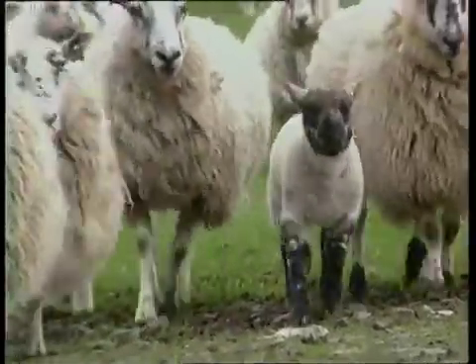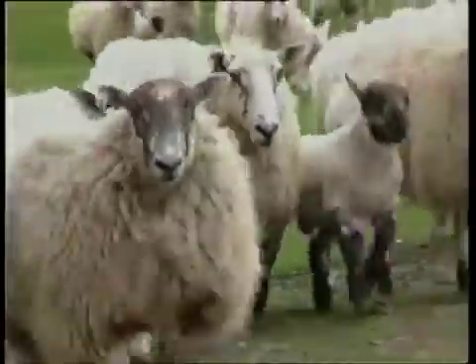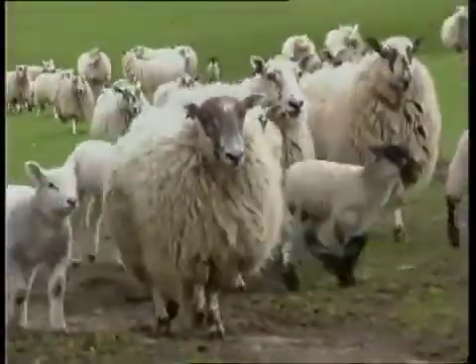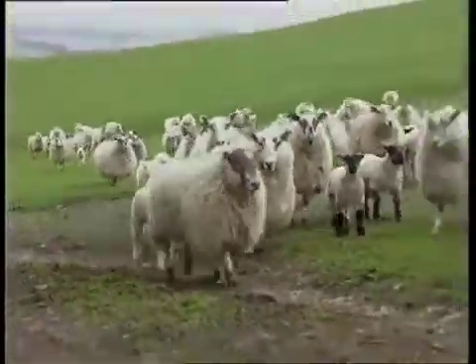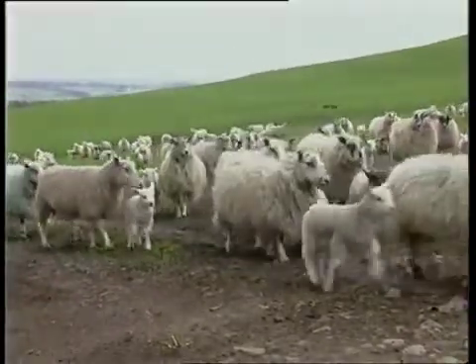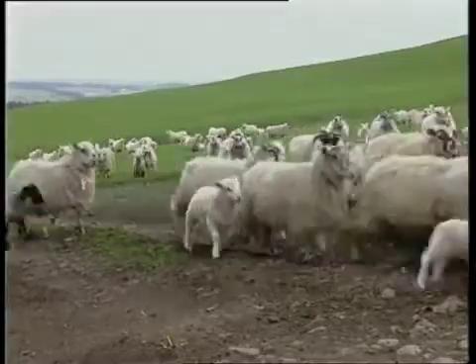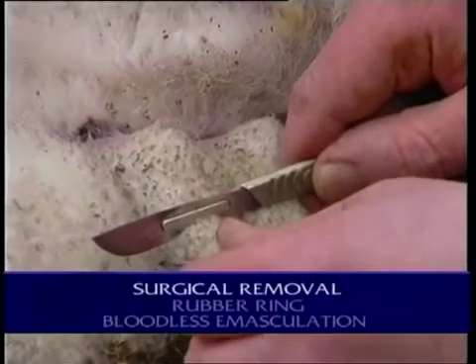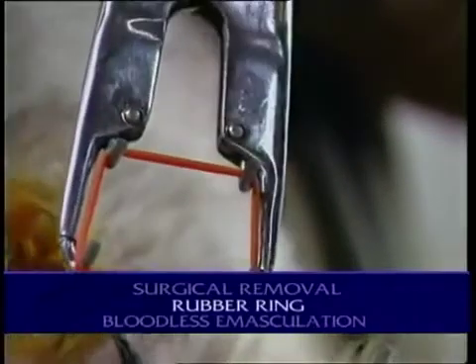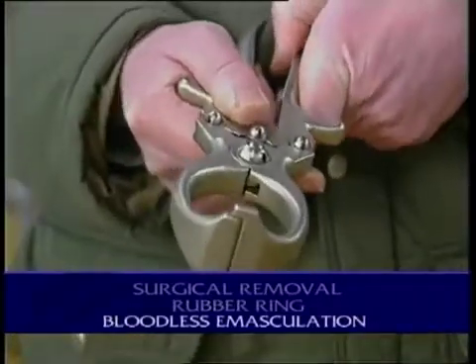Nobody likes to carry out unnecessary operations on their livestock. But where lambs can't be finished before grass supplies run out, castration of male lambs to control breeding remains a necessity. There are currently three main methods in use: surgical removal of the testes, the rubber ring or elastrator, and the bloodless emasculator.